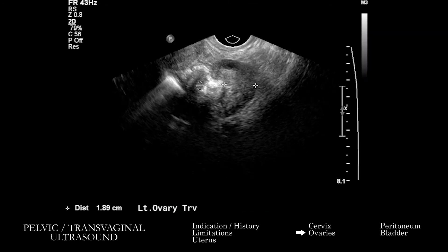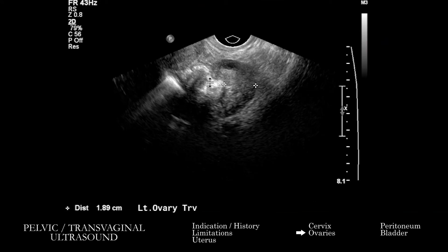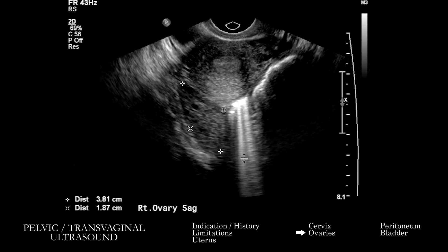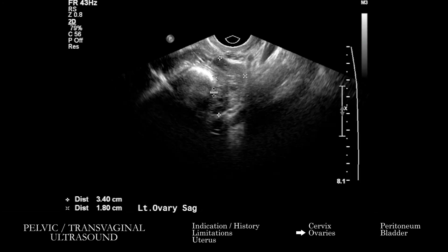Especially if there's concern for torsion, when we go through the cine clips of the adnexa, you want to take a look on grayscale at the vascular pedicle. In addition, not just within the ovary itself, you want to be looking adjacent to the ovary — whether there's any adnexal lesion, whether cystic or solid. That includes both adjacent to the ovary as well as impacting the fallopian tube.